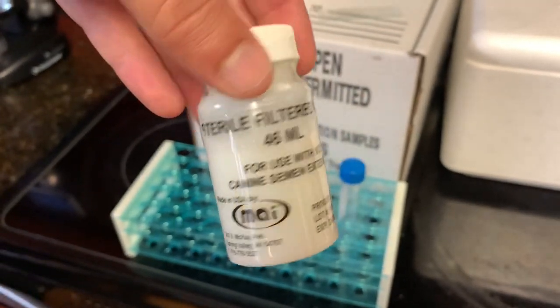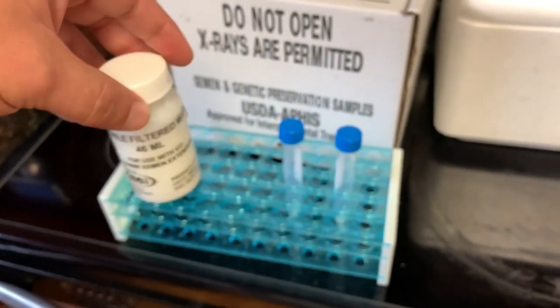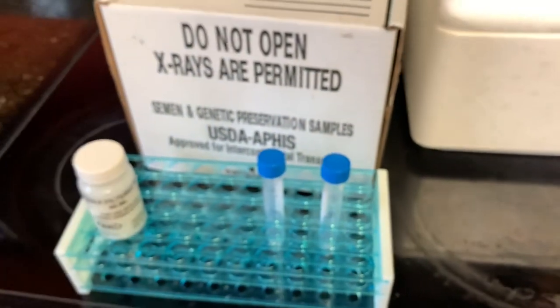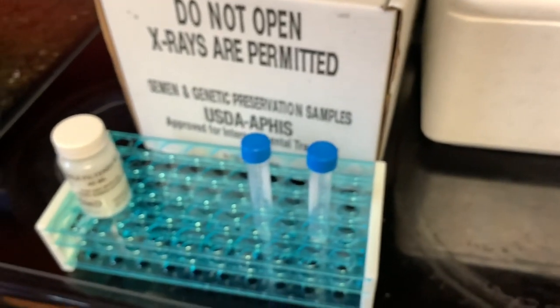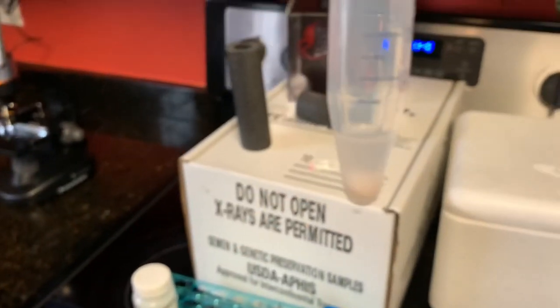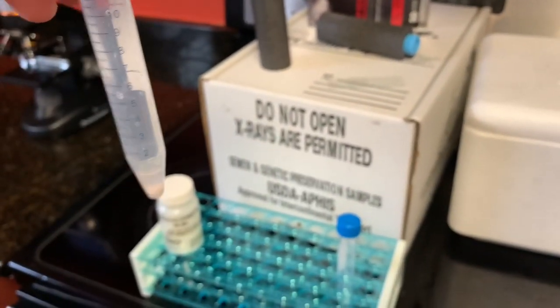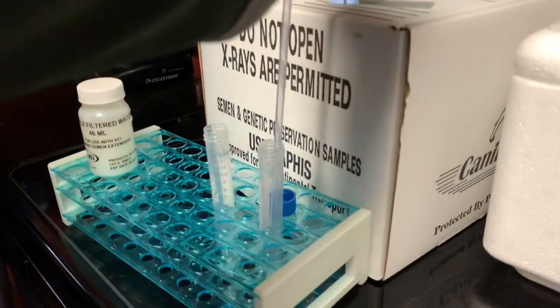This extender, we're gonna be doing 4-to-1. So what we have to do now is use that syringe that we just had. Justin, will you get that syringe for me? All right, is it cleared out? We're gonna collect these two vials of semen into the syringe so we know exactly how many cc's we have. So go ahead and collect both of those in there for me, Justin.